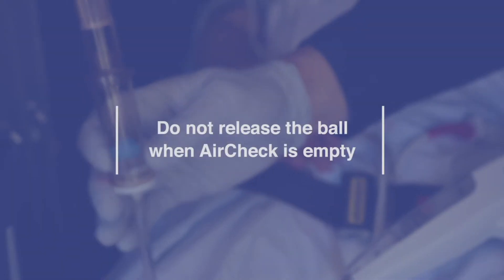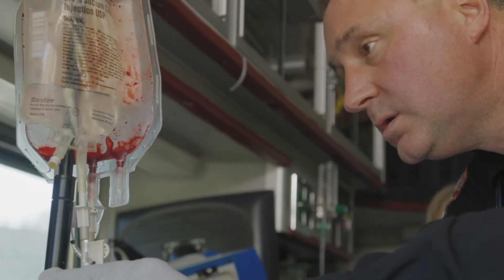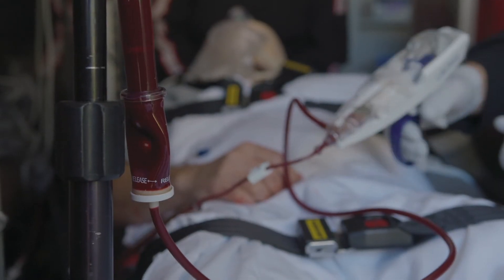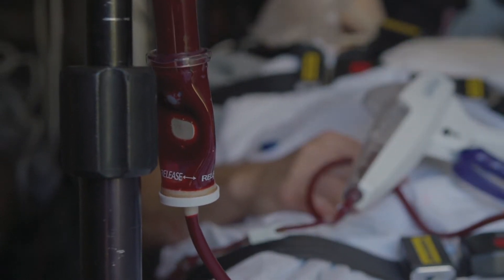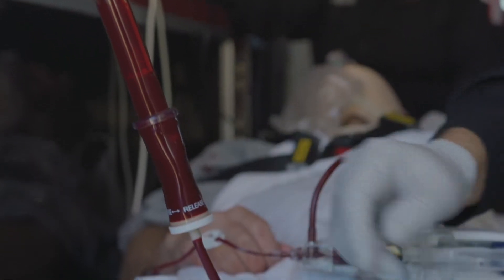Do not release the ball when the air check is empty. Blood bags contain a minimal amount of air, so you should stop infusing while a small amount of blood remains. If you continue squeezing for too long, a vacuum may develop in the air check chamber. If this happens, simply open the clamp on the saline bag to release the vacuum.